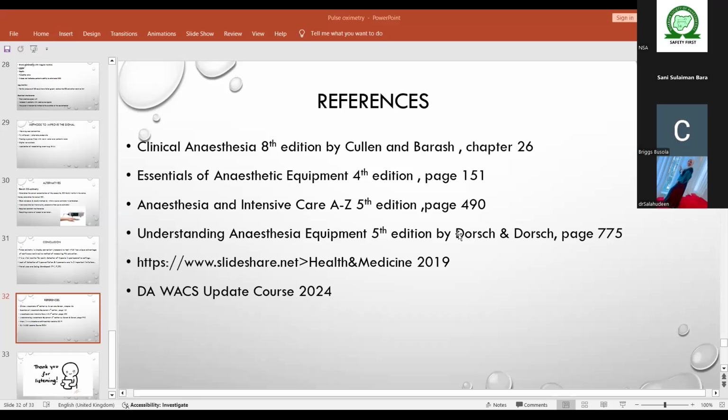Yeah, you're coming close. One patient tends to have carbon monoxide poisoning. So they have the carboxyhemoglobin wavelength interfering in the medium that the light emitting diode of the pulse oximeter wants to transmit, relay and interpret to us. So it can give us false readings. In which categories of burn patients now? Carbon monoxide also. Which category of burn patients now?